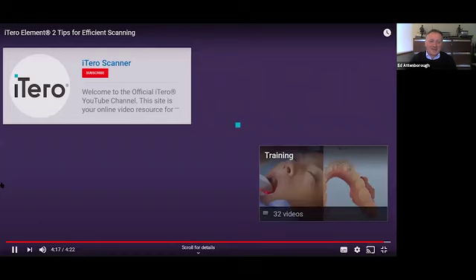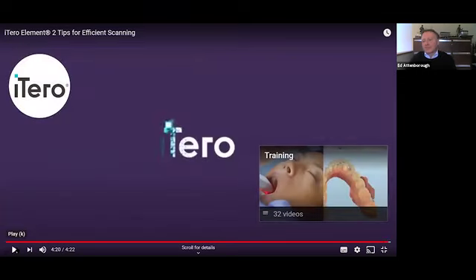All right. So, a couple of points there before we go on to the next slide. The structured light scanners have a certain depth of field. So you can see with some of the scanners, they tend to rest on the teeth. If you're not resting on the teeth, you do need to rest your hand in a way that you're steady, because obviously jittering around with your hand is going to cause multiple recordings, and we'll come on to look at some of the issues that can cause a little bit later on.